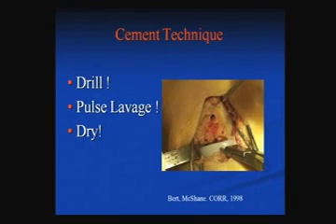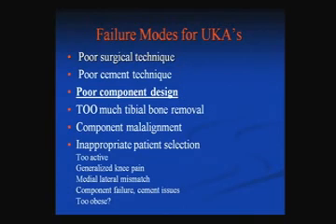Poor cement technique, I think, is critical. We have published a study, Bill McShane and I did, in CORR in 1998 using drill, pulse lavage, and drying in both totals and unis, and found this gave the highest incidence of reduction of liftoff and shear when checked in both total knee replacements and unis.